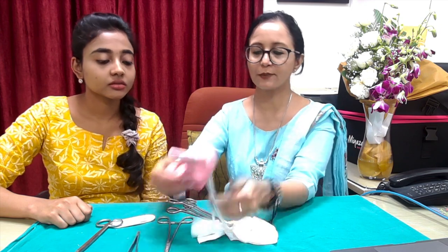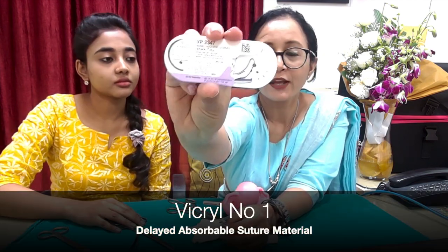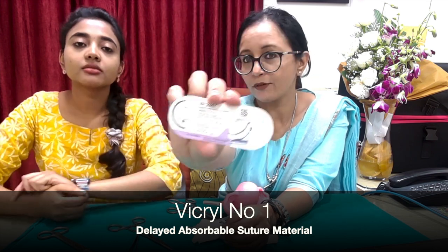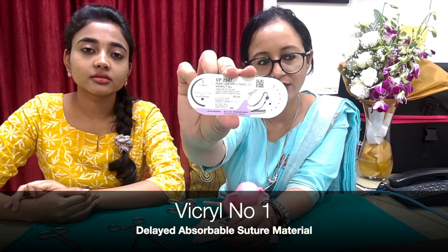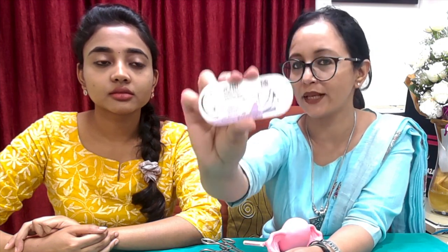The L-shape means you go straight then turn 90 degrees. To check your pedicle is correct, see whether your clamps can move properly — otherwise pedicles will cluster together and you can't check hemostasis individually. For tying, there are two kinds of ties: the free tie and the transfixation tie. We use Vicryl number one for most pedicles — delayed absorbable suture — for 99.9% of our surgeries.